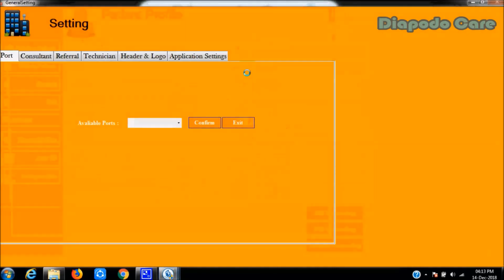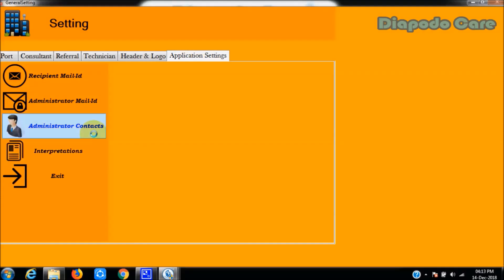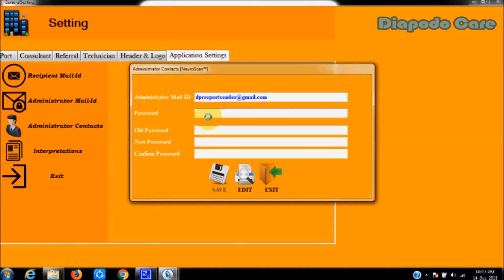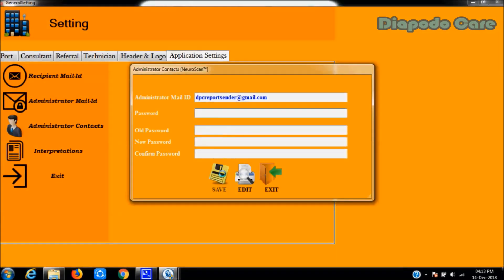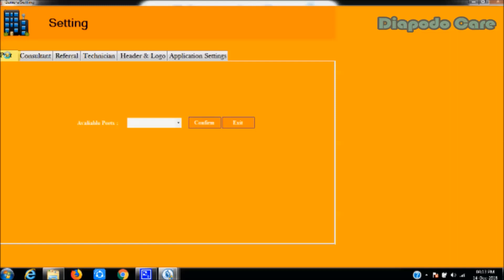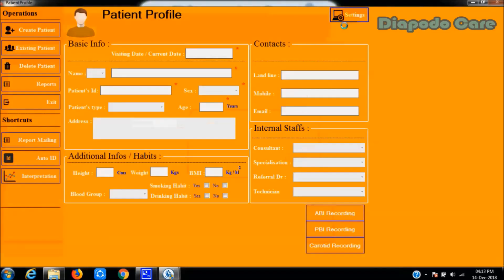The settings panel of Vassabi will now open. For uninterrupted work, the user must save an administrator email ID in the administrator contacts option from the application settings panel. A Gmail or Yahoo email ID must be used as the admin email. After saving the administrator email, the user must save the communication port number from the ports tab, selecting the correct port from the available ports option, then clicking the confirm button for hardware communication.